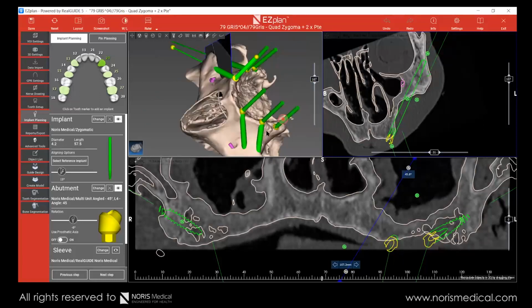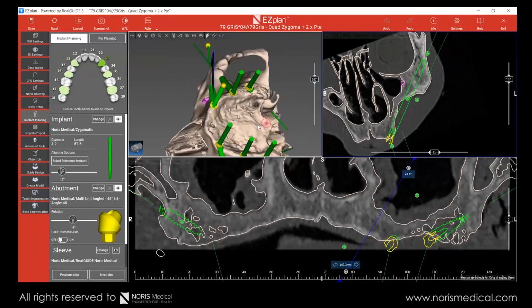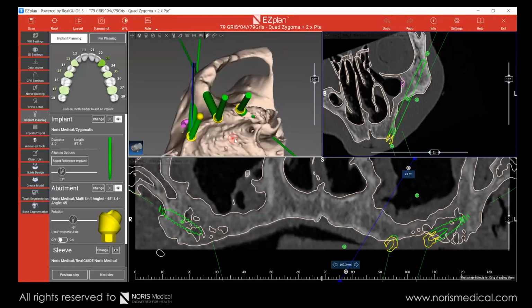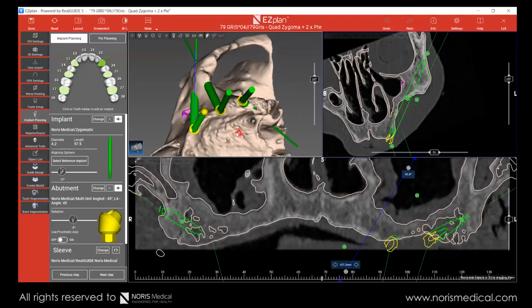You see here. This is what we're looking at. This is the angle. We see what we see here. This is the amount of bone supporting. This is not a case for anterior zygomas. It's just a very nice case to explain the angles. Okay, so in this case we could put a regular implant here and just put the zygoma in the posterior, but it's very easy to explain. So forgive me about that. Later on, we'll see other cases which are more difficult to do.